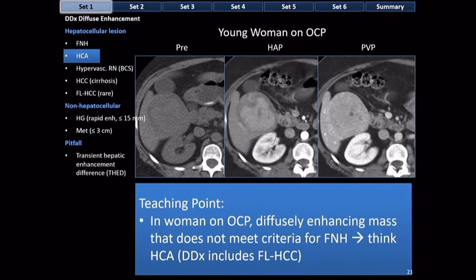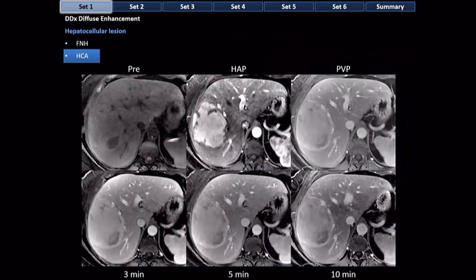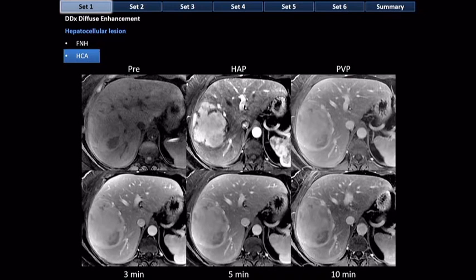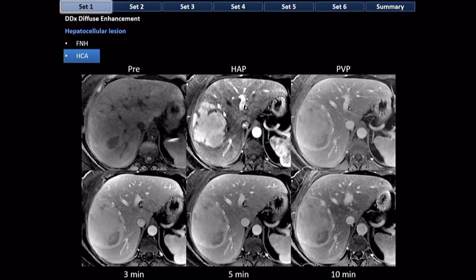Keep in mind that you don't clinch the diagnosis of adenoma in this particular case, and a fibrolamellar HCC cannot be completely excluded. Here is the inflammatory subtype of hepatocellular adenoma — diffuse but heterogeneous enhancement not explained by central scar and fibrous septa. These inflammatory hepatocellular adenomas tend to have telangiectatic change and dilated sinusoids, so they hold on to contrast on delayed images. At five and ten minutes most of the mass remains hyperenhancing. They can also contain a little fat, but unlike HNF1-alpha inactivated adenomas, they're not diffusely steatotic.